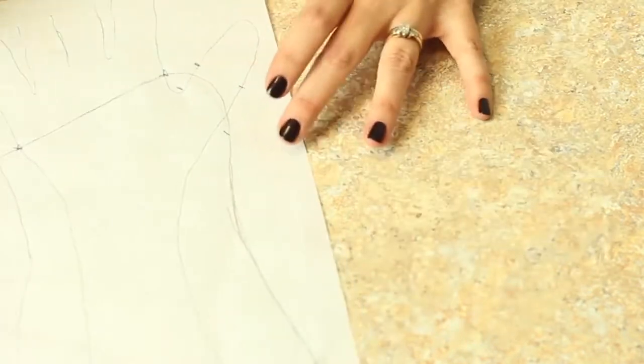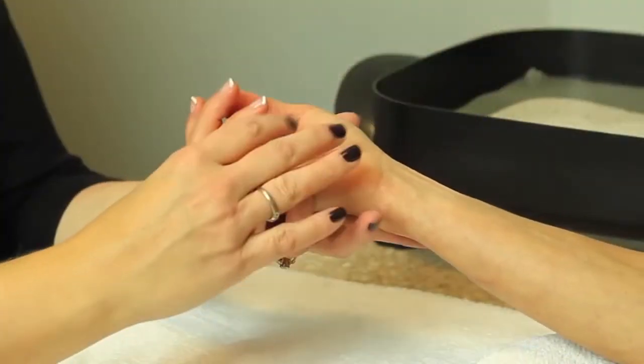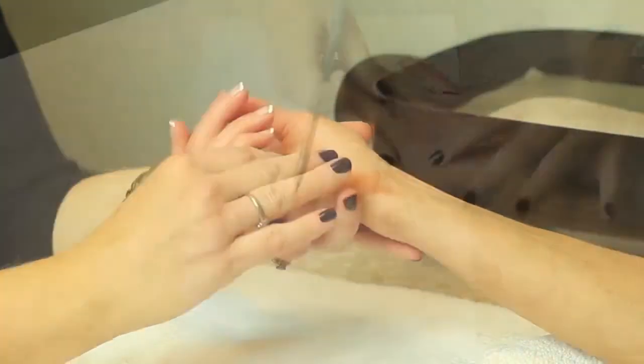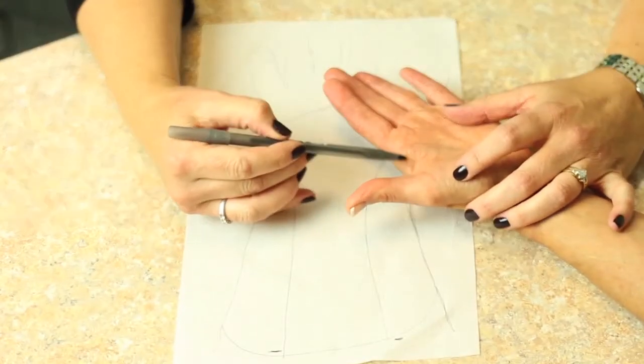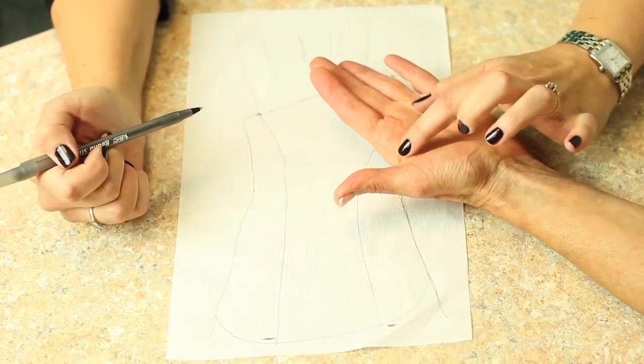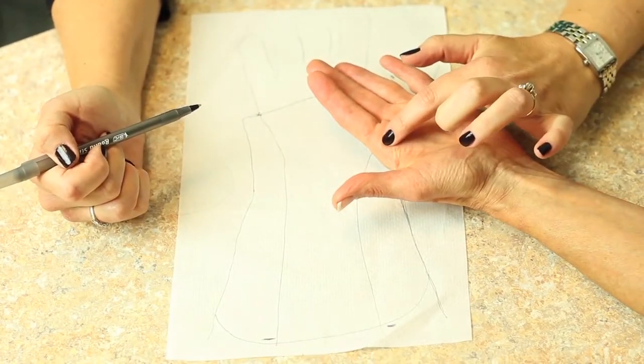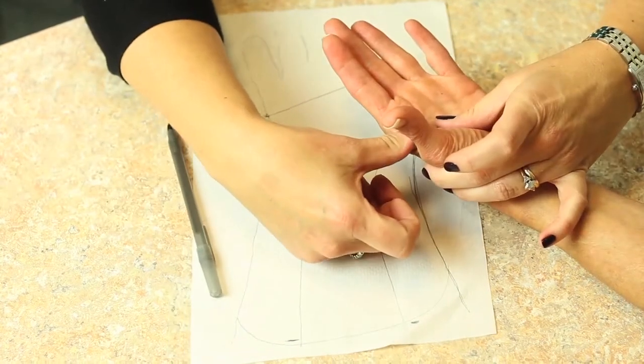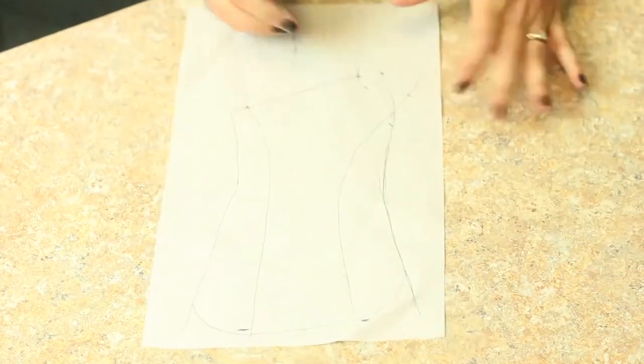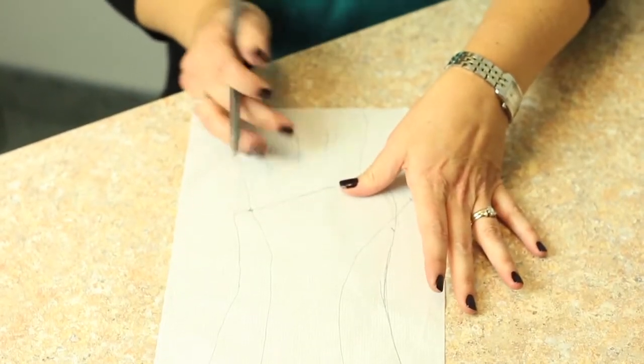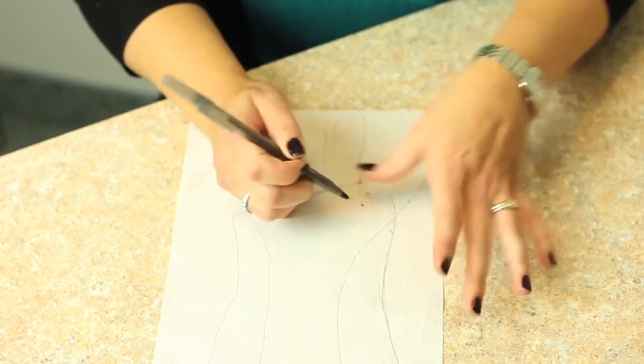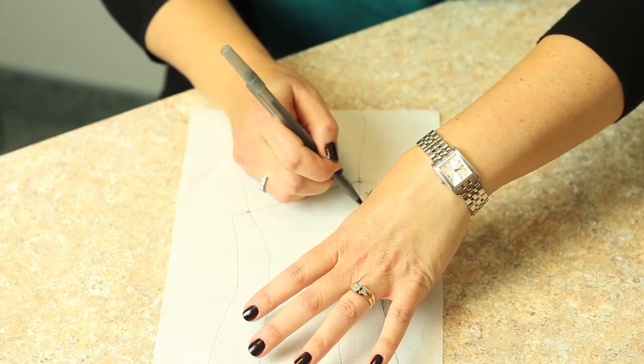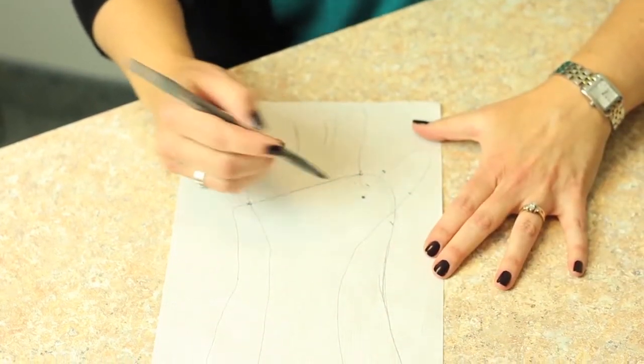The placement of the thumb hole can also be a little bit tricky so look at the patient's hand and get a sense for the width of that web space so that would be from the MP joint of the thumb up to the distal palmar crease and generally that's about a thumbs distance. When you look at your pattern what you want to do is bring it down about a thumb from the distal border and the same on the radial side and that should be where your oblong shaped hole is going to start.